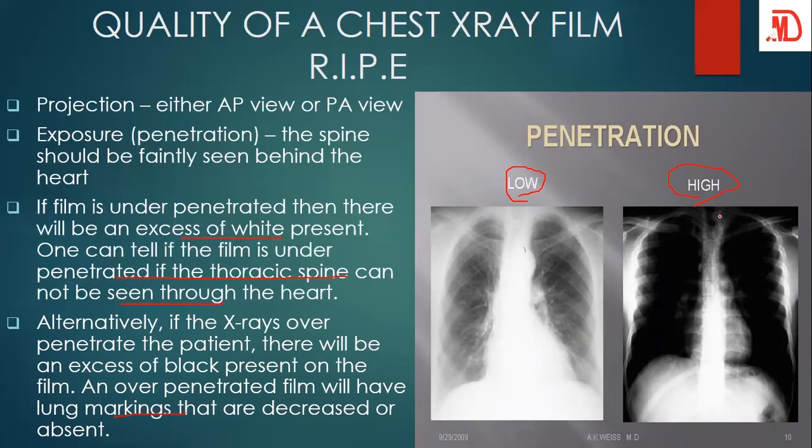And then we now have the high penetration. Look at how black it is. You might even think this person is having a pneumothorax, right? Maybe, or maybe not. Look at it, you can't really see some landmarks over here. There's supposed to be some things over here, but you can't even see them. That's why we say some landmarks are decreased or absent when it is overexposed.